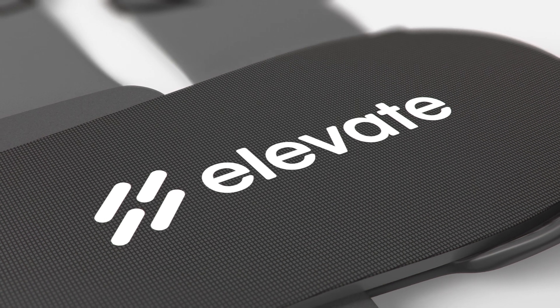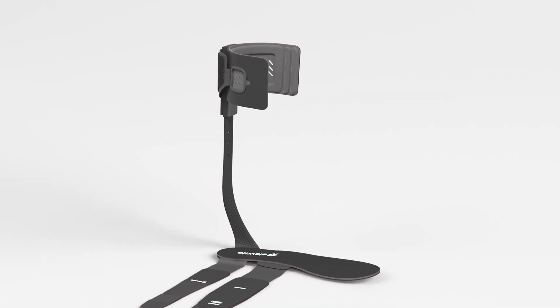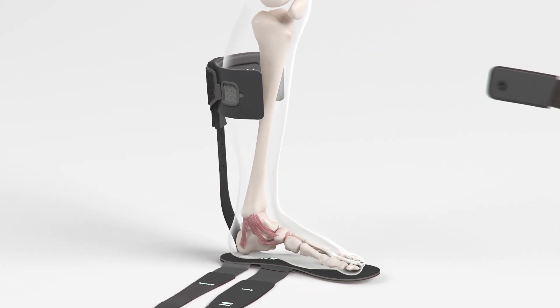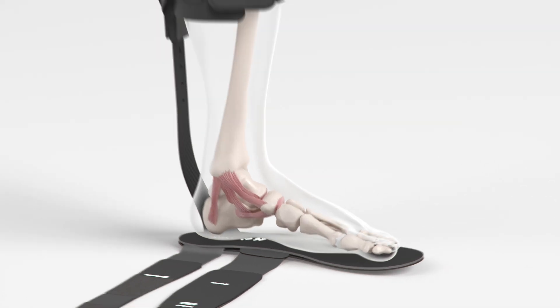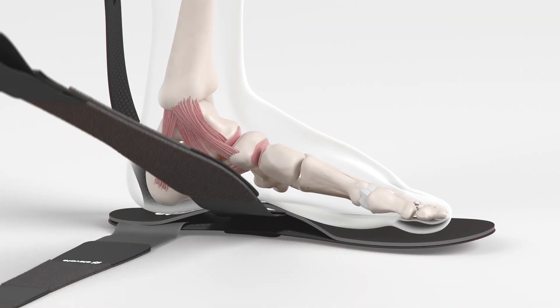The helix band is our powerful accessory that attaches to our AFO footplate. The dual strapping system dynamically pulls the arch and calcaneus out of the pronated or supinated position to a more neutral position, preventing the ligaments from stretching during the gait cycle.